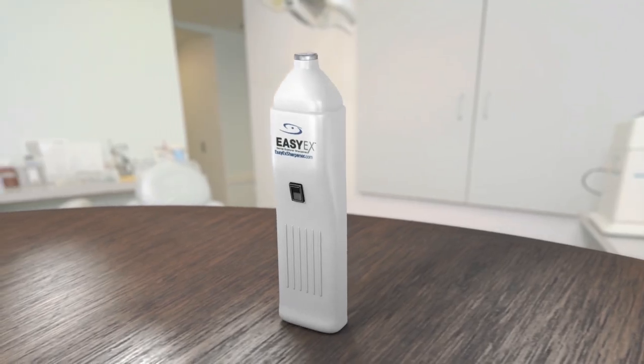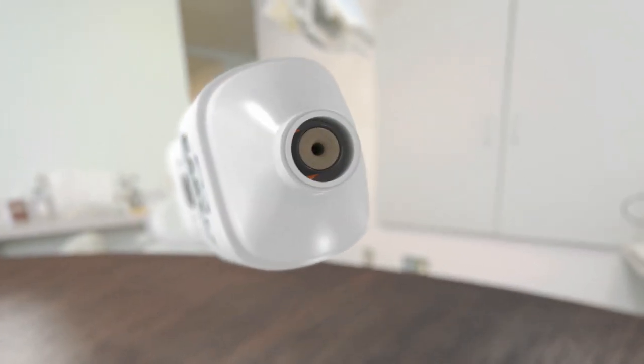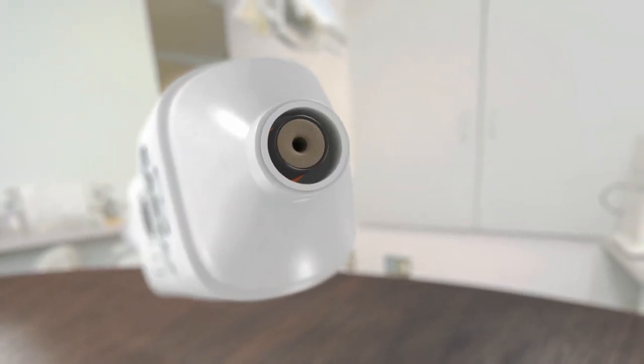Using a concave stone spinning in an orbital motion, the EasyEx quickly resurfaces the explorer tip. With the EasyEx, you'll soon be diagnosing treatment that your dull explorers have been missing.